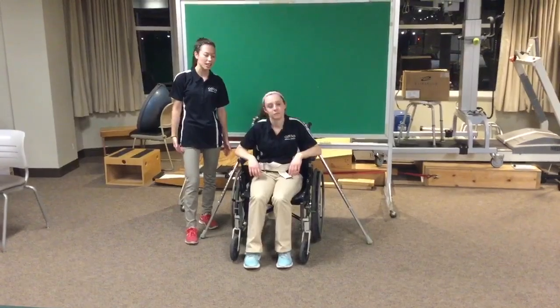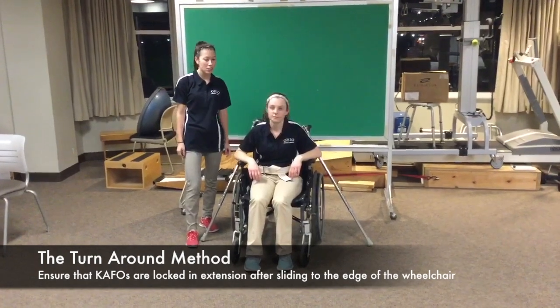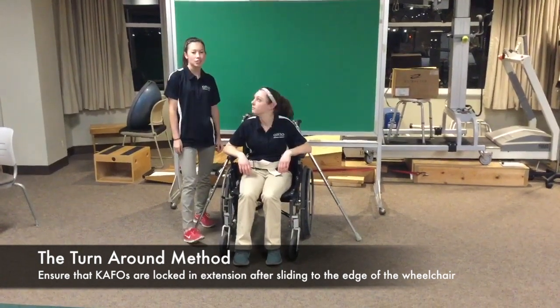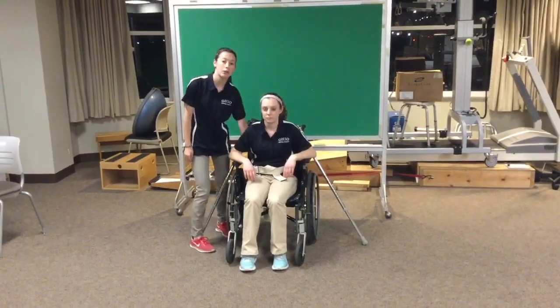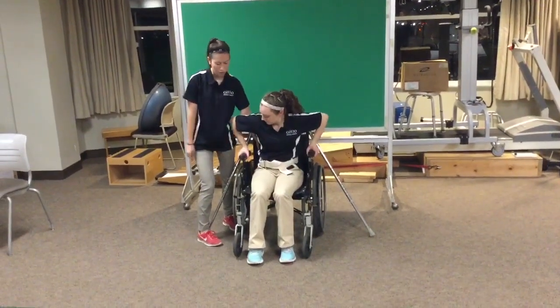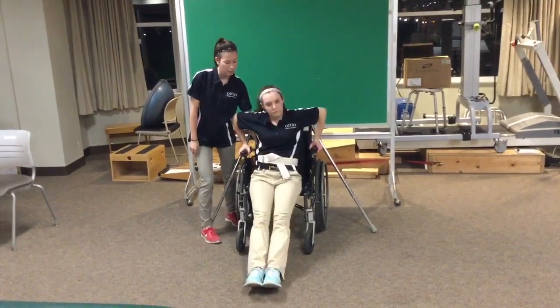There are two methods to stand from sitting in the wheelchair. This is going to be the turnaround method. You're going to begin with the patient's wheelchair locked — I have confirmed it's locked on both sides — and you're also going to have the patient in the gait belt and hold onto the gait belt at all times. Next, Colleen, I'm going to have you reach both of your arms to grab the arms of the wheelchair, and then slide forward so your bottom is at the edge of the wheelchair.